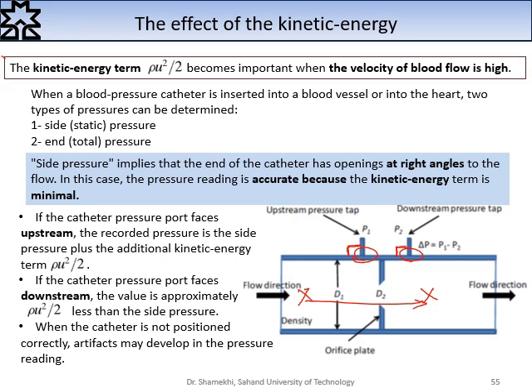When the catheter is not positioned correctly, artifacts may develop in the pressure readings. For these two cases, imagine you are in a river, and if you face upstream, you will sense more pressure from the water inside the river.